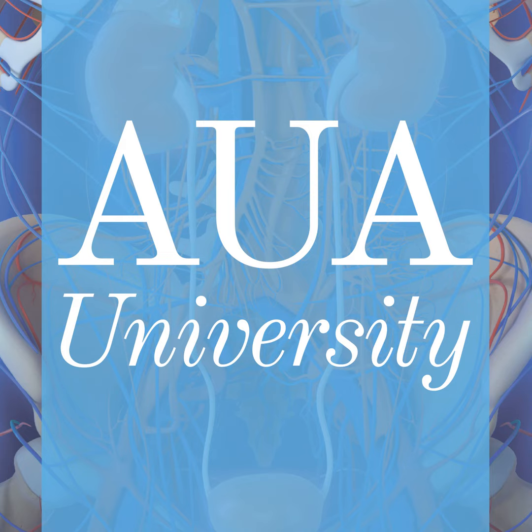When we look at the detection rates of the resected and recurrent prostate cancer, then the PSMA PET scan is even superior to a multiparametric MRI to identify this locally recurrent disease. And also the PSMA PET scan is superior to the MRI to identify patients who have organ-confined or locally advanced disease. However, as in the situation of the initial primary staging in locally advanced disease, the PSMA PET scan still does poorly in identification of pelvic lymph nodes.